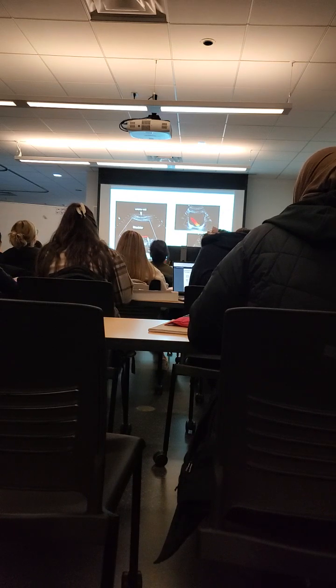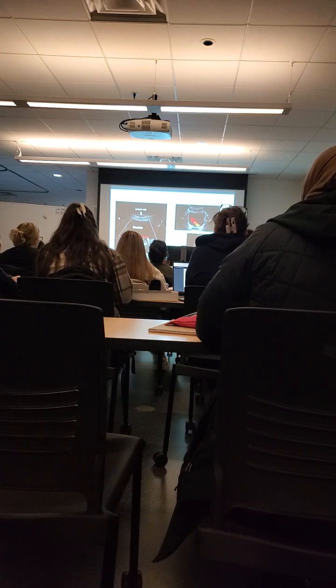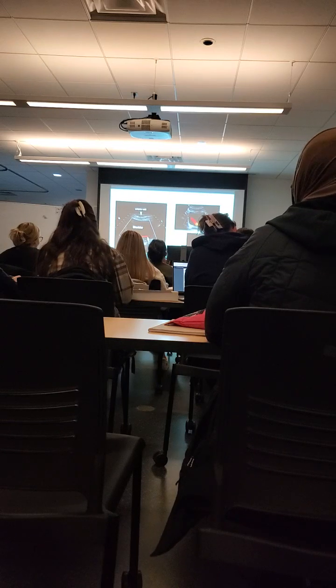So I took a lot of different examples here. Most of the time, the ureters are going to look like this. When you put color on it, this one is coming from this side, which, if I cut this in half, is that the left or the right ureter? Left. It is the left, especially because it's aiming this way, right? Because they're coming in posterior, and then it's going to shoot out. So it's going to go this way, this way. They're going to cross most of the time. And so this is going to be your left.